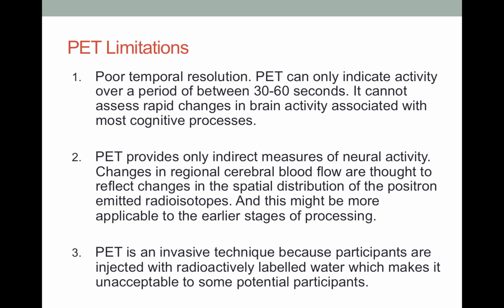But PET suffers from some major limitations. It has poor temporal resolution. PET can only indicate activity over a period of between 30 to 60 seconds. It cannot assess rapid changes in brain activity associated with most cognitive processes.